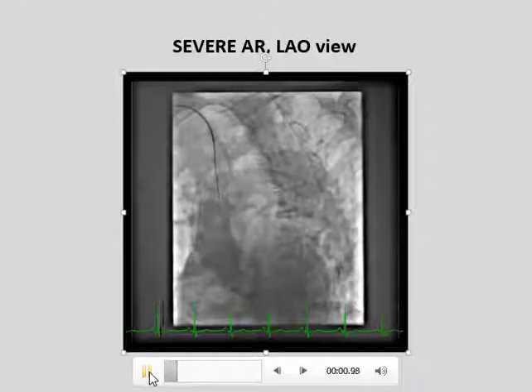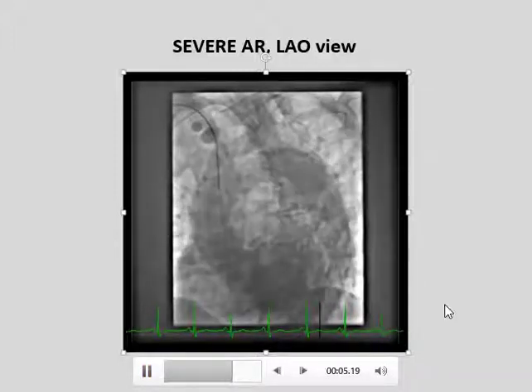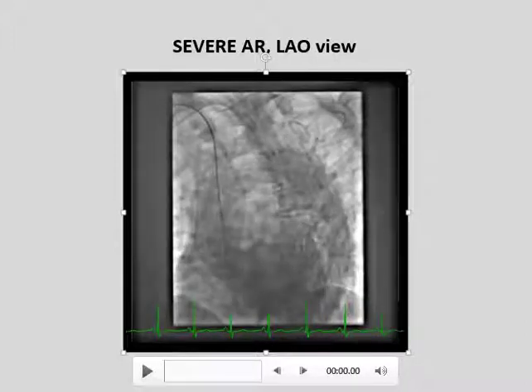Again, another one not on repeat, but you can appreciate the severity of that aortic regurgitation that would be quite restrictive to the patient. And again, out of interest, I would encourage you to read up in anticipation of your lectures next year on the underlying pathology, particularly for the aortic valve and the mitral valve. That'll cover a lot of ground for you in advance.